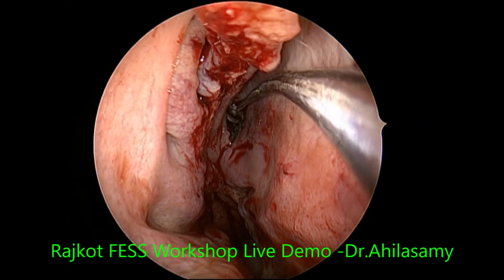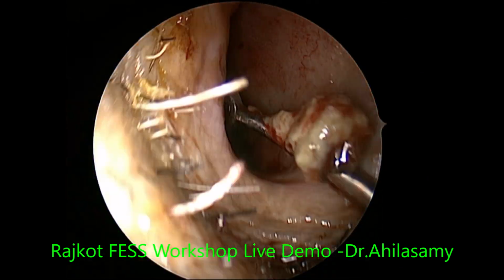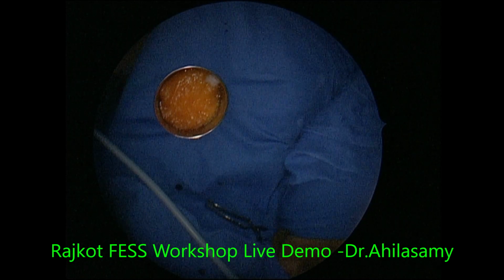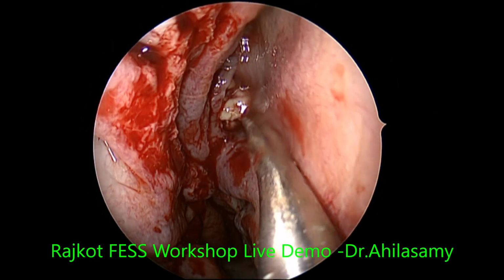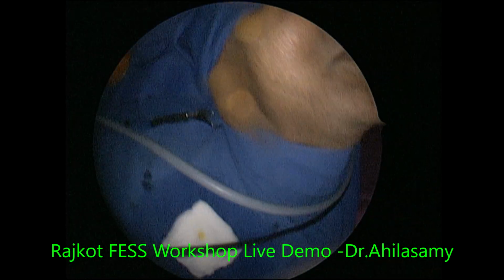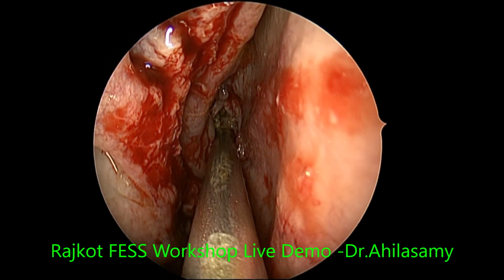Now I am using a ring curette not to scrape, but to take material for histopathological examination, fungal culture, and KOH smear. So again I am taking some more material for histopathological examination. After that, when you use the suction and everything, you will not get material. So take enough material for the analysis. Now I am using a straight suction to suck the material.